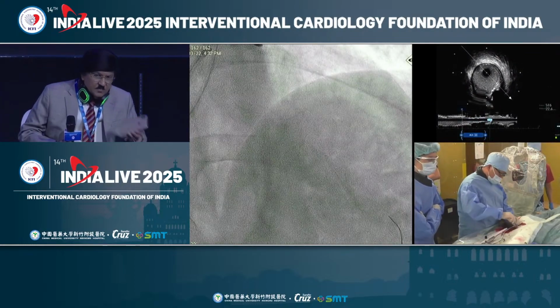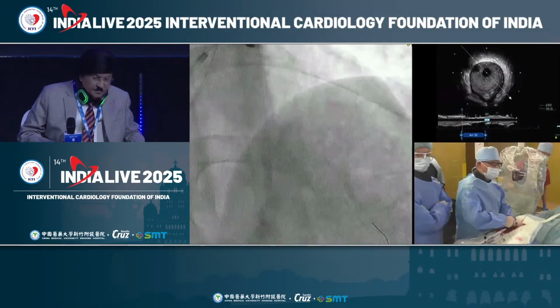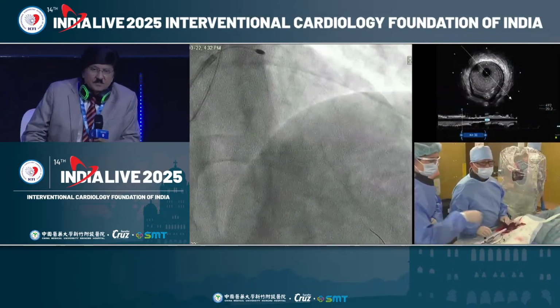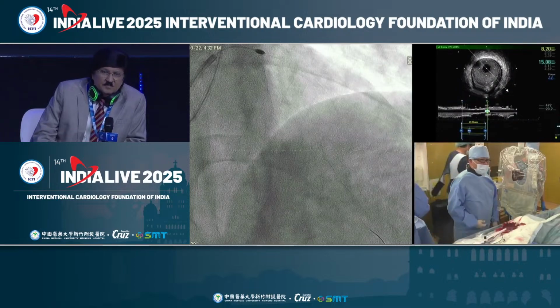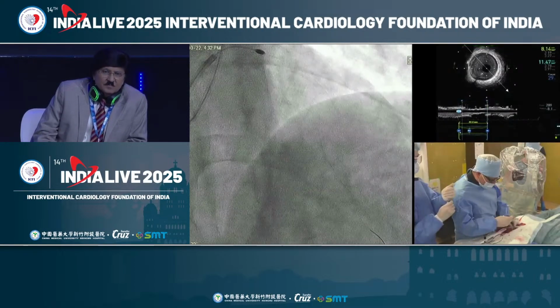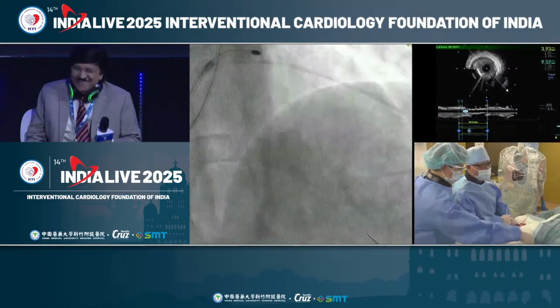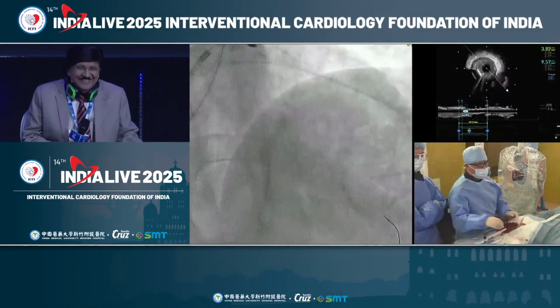Yes, exactly. Nagama sensei, thank you so much for your comment. Of course, IVL is a very useful device. However, IVL never promises a good result every time. The problem is that nobody knows when IVL will fail or not.